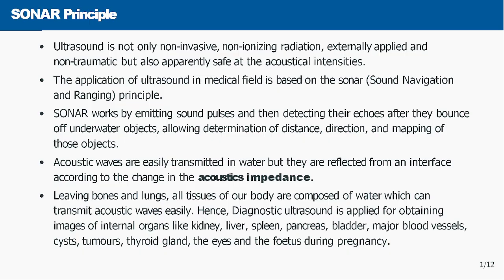Actually, this ultrasound is non-invasive, it is non-ionizing radiation, it is applied externally, and it is non-traumatic. It is also apparently safe because it uses acoustic signals, or sound. The application of ultrasound in the medical field is based on sonar technology.